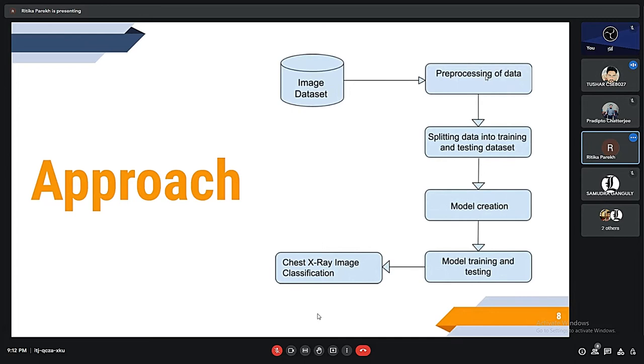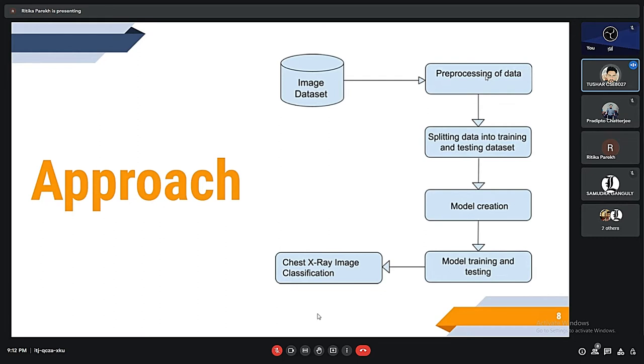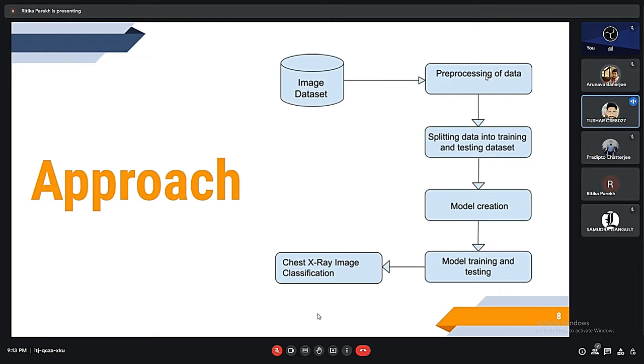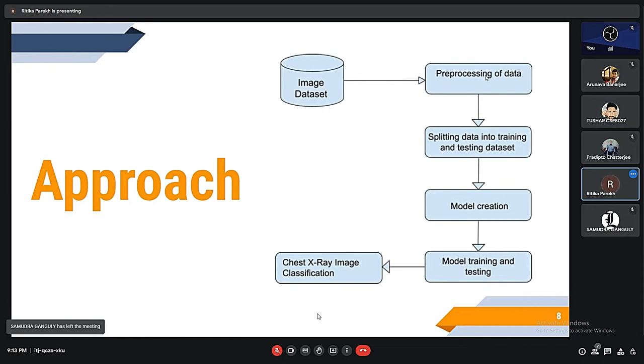Our approach is first we collected image dataset then we process them into two datasets: training model and testing dataset. Then we trained the model for testing and then we take X-ray image and classify them if the person is COVID positive or not.